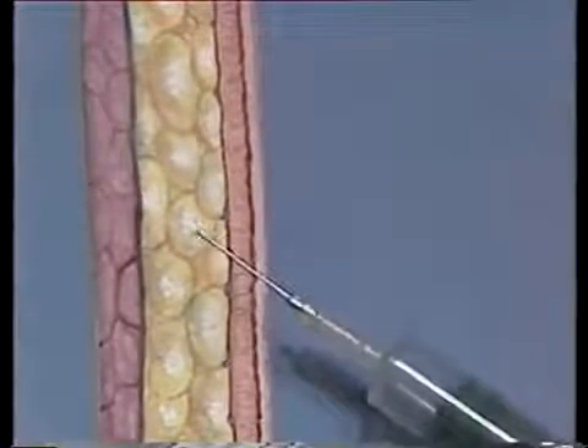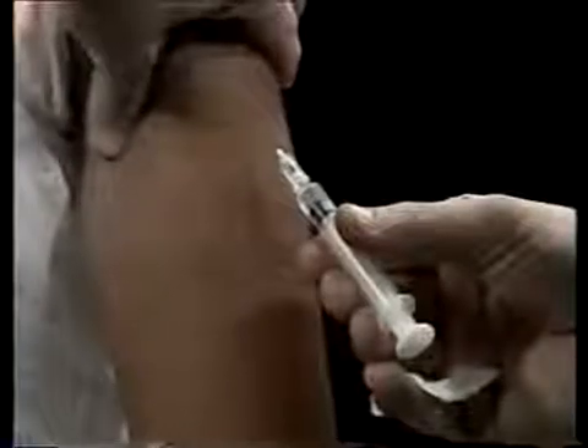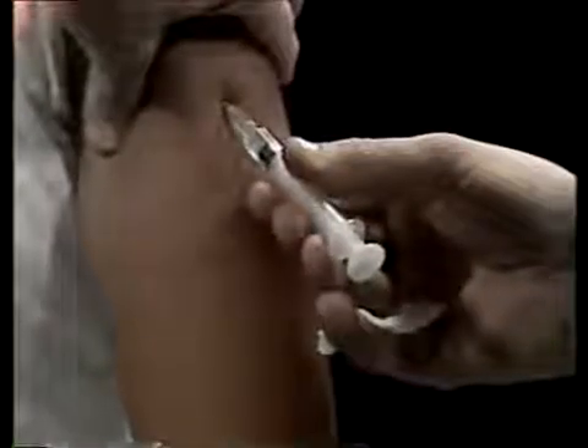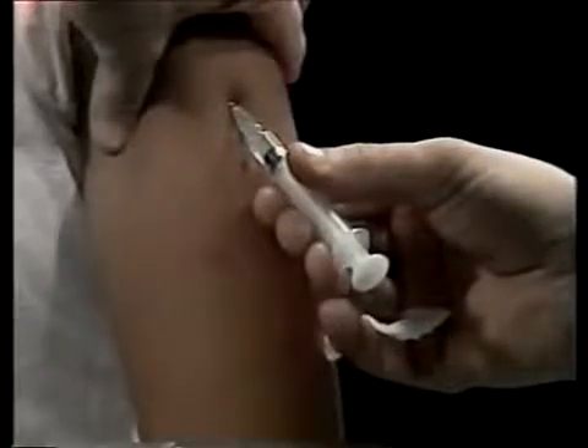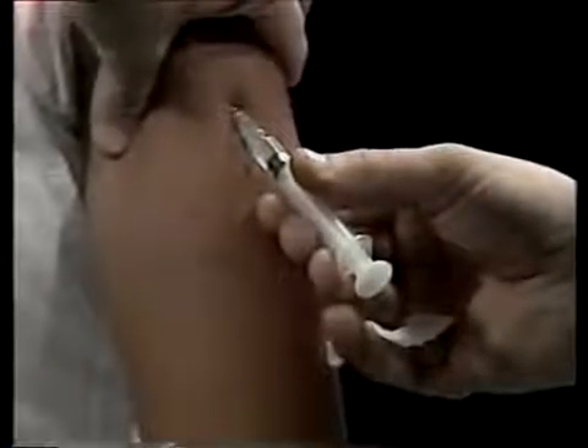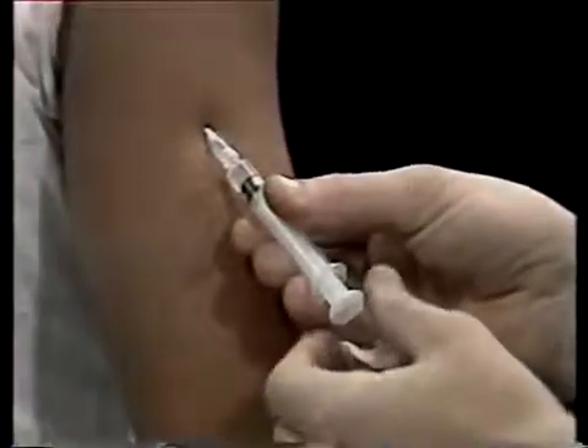Straight in is 90 degrees; 45 degrees is halfway. Insert the needle at this 45-degree angle into the skin with a firm, quick forward thrust. When the needle has penetrated the skin, you can release your pinch and move your free hand to the plunger of the syringe.